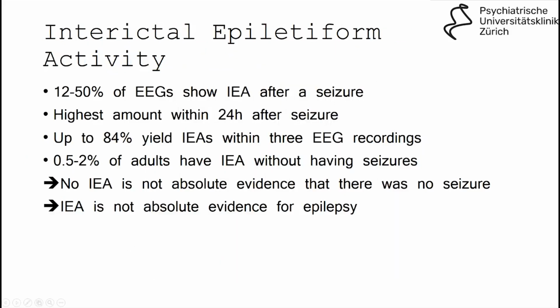So you learn now that there are some patterns that can occur mainly when you're very young or drowsy, and these patterns do not necessarily indicate that there is an epilepsy going on.